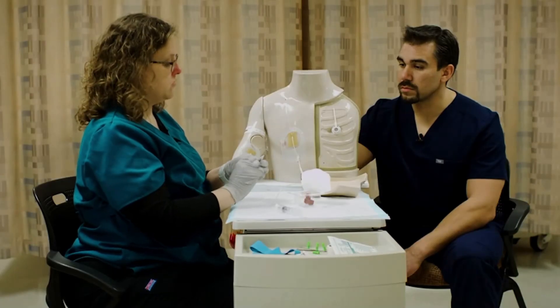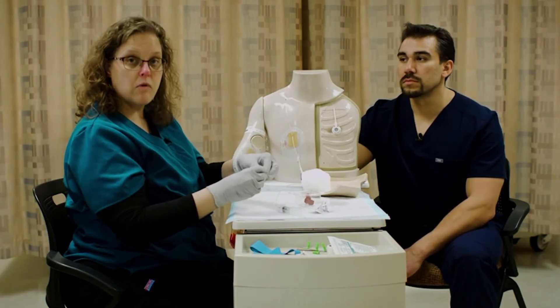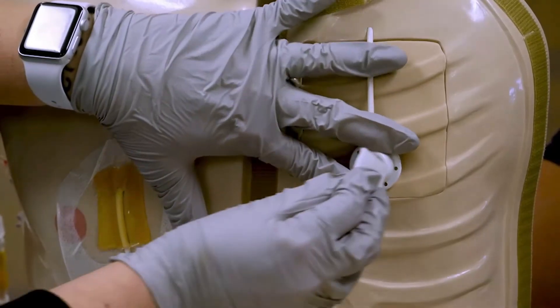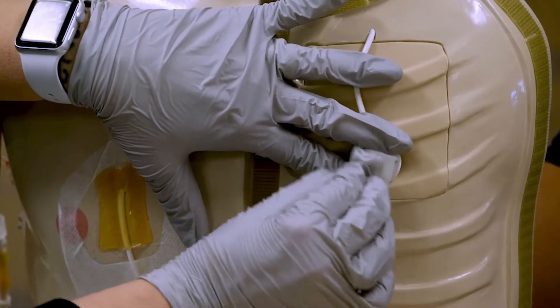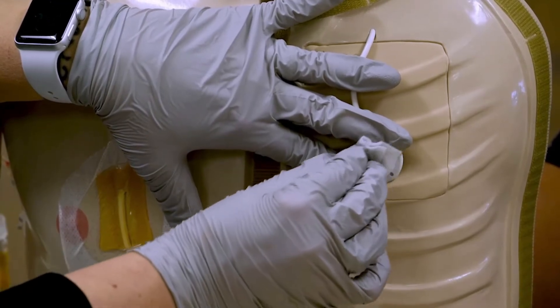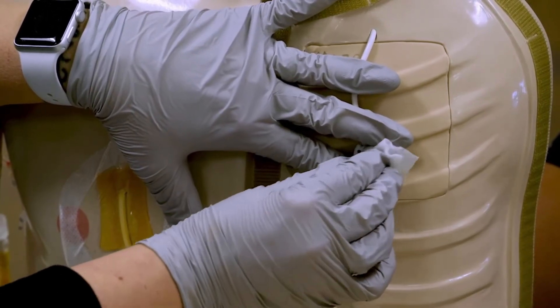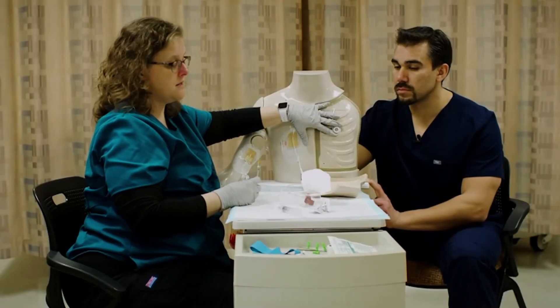So I'm going to stabilize this with one hand while I clean it. Your facility will tell you exactly what you need to do to clean it. I'm just using a chlorhexidine wipe so that you can see. This is going to be cleaning the skin directly over that little rubber port, and this is typically a completely sterile procedure. So you're going to want to be very mindful of what hand is dirty and what hand is clean.